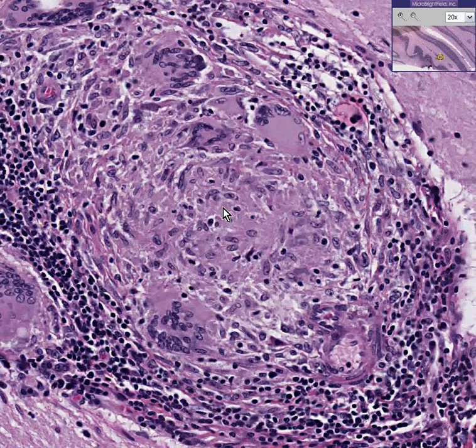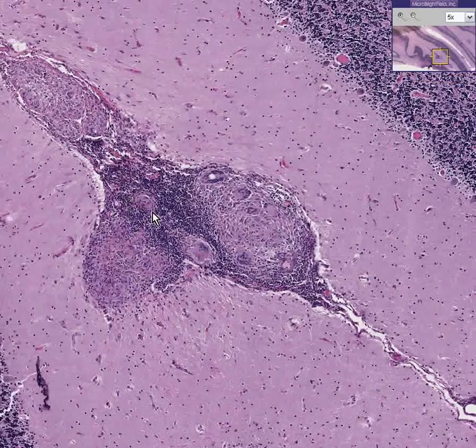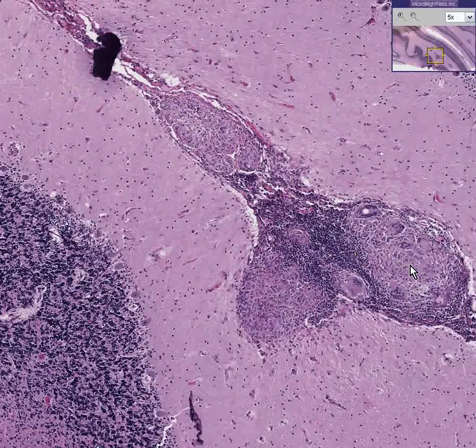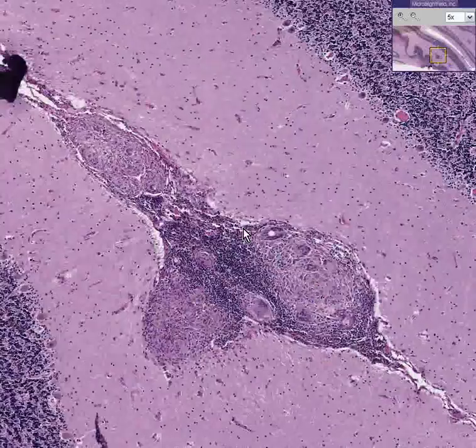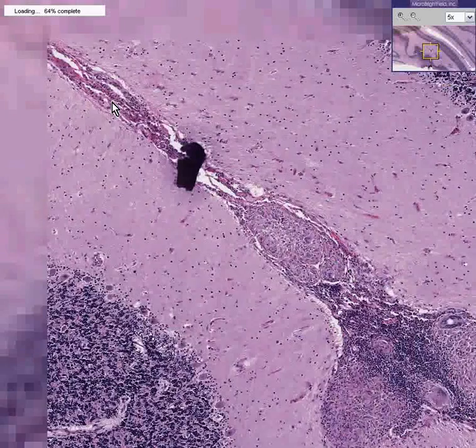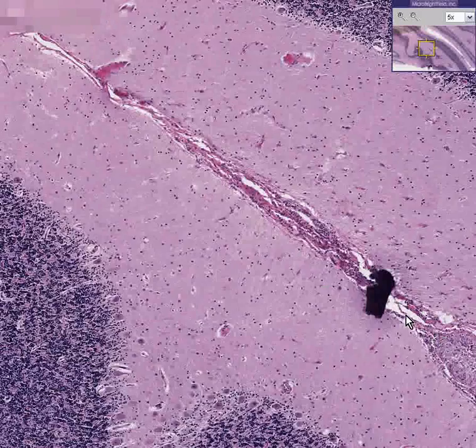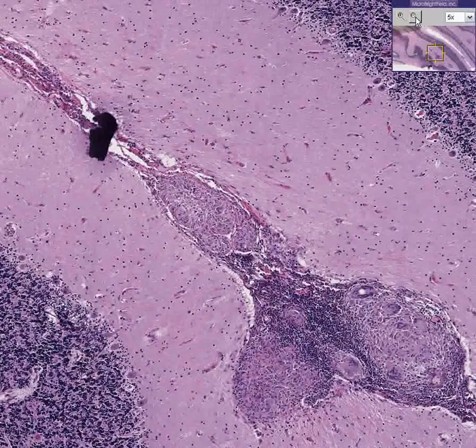But the classical and most common thing that you think of when you hear non-caseating granulomas anywhere in the body is sarcoidosis. And sometimes it's kind of an exclusion diagnosis. Perhaps you can take some of this material and culture it if it was a biopsy. And if all the cultures were negative, you might say, well, they're non-caseating granulomas and they're not due to any culturable organisms. Often that is the most strongly suspicious thing that you have to make you think of sarcoidosis.